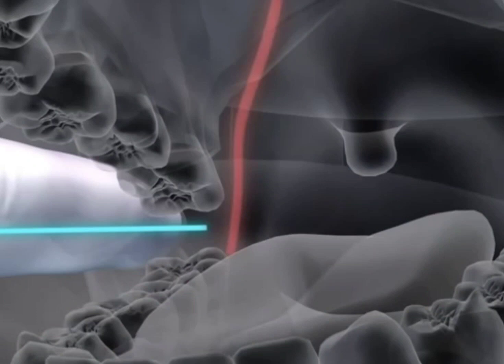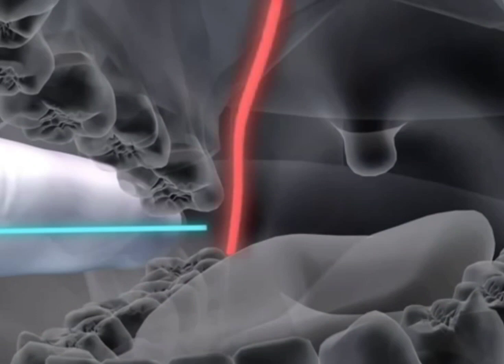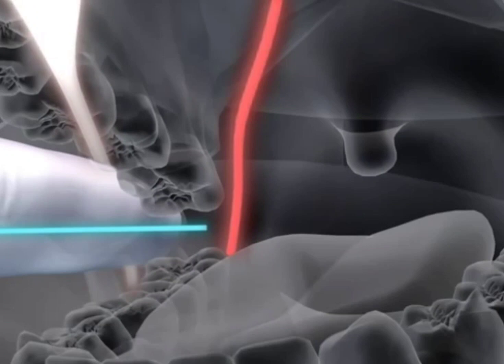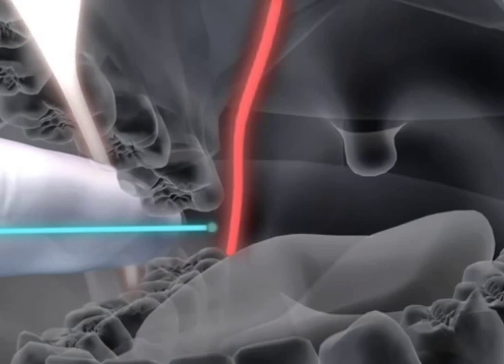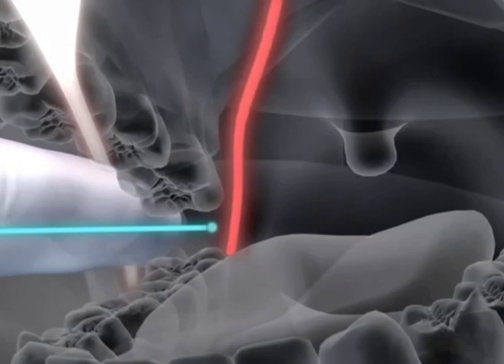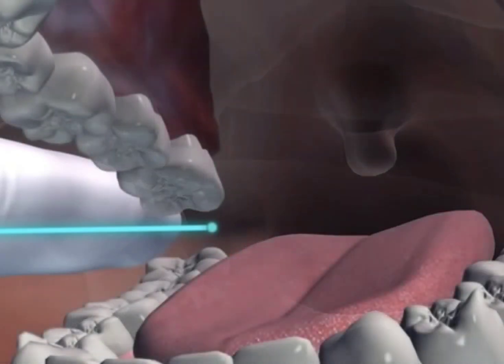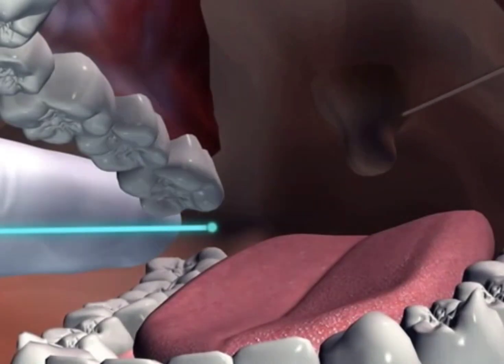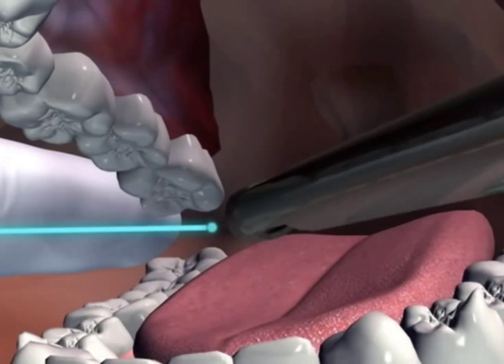The operator should visualize the pterygomandibular raphae and the deep tendon of temporalis under the finger as forming a triangular area under the pterygomandibular depression. Positioning the syringe over the premolar teeth on the opposite side and just above the plane of occlusion, the needle is placed at the insertion point within the depression, about one-fourth to one-half the distance from the raphae to the finger.